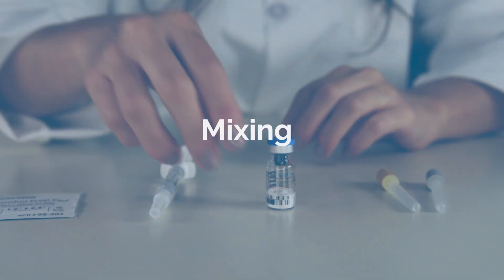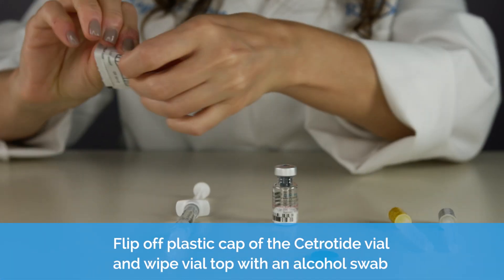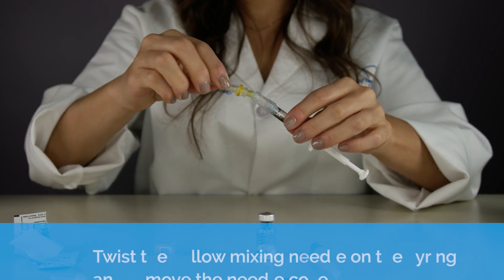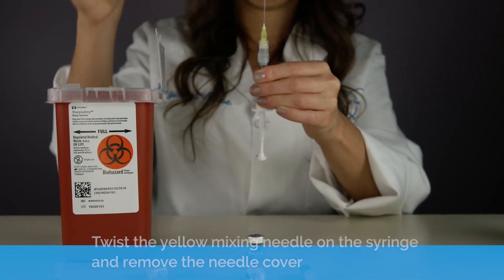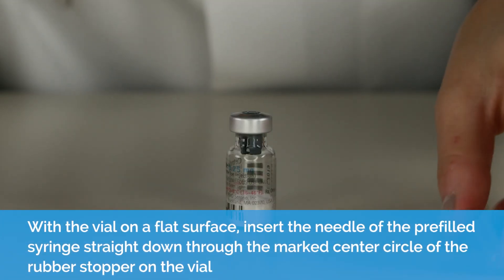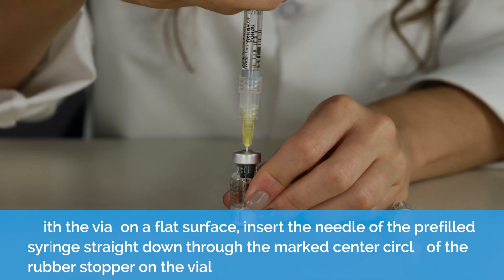Mixing. Flip off the plastic cap of the cetrotide vial and wipe the vial down with an alcohol swab. Twist the yellow mixing needle on the syringe and remove the needle cover. With the vial on a flat surface, insert the needle of the pre-filled syringe straight down through the marked center circle of the rubber stopper on the vial.